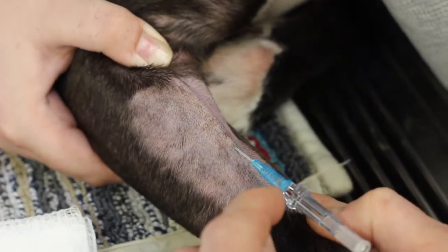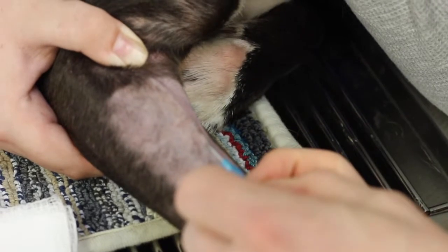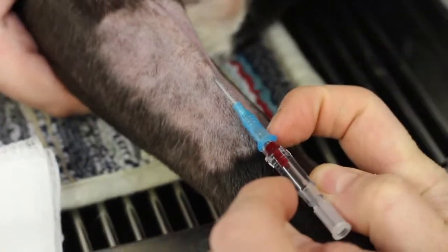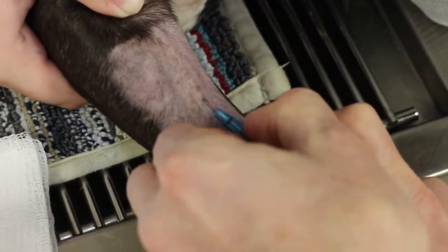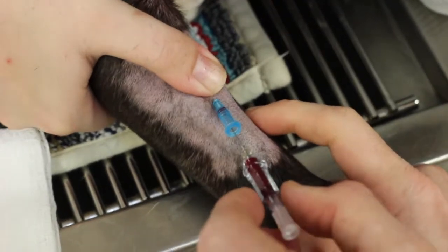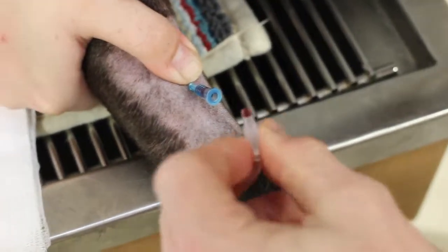I got a little blood back — I think it went right in the vein, and it's still oozing, but I think I went too far. So I'm going to pull it back just a hair. Now the blood is flowing nicely, so I think I'm in the center of the vein. I'm going to hold this stylet very still and move the catheter up along the stylet. That's fully threaded. Then I'll pull the stylet out.